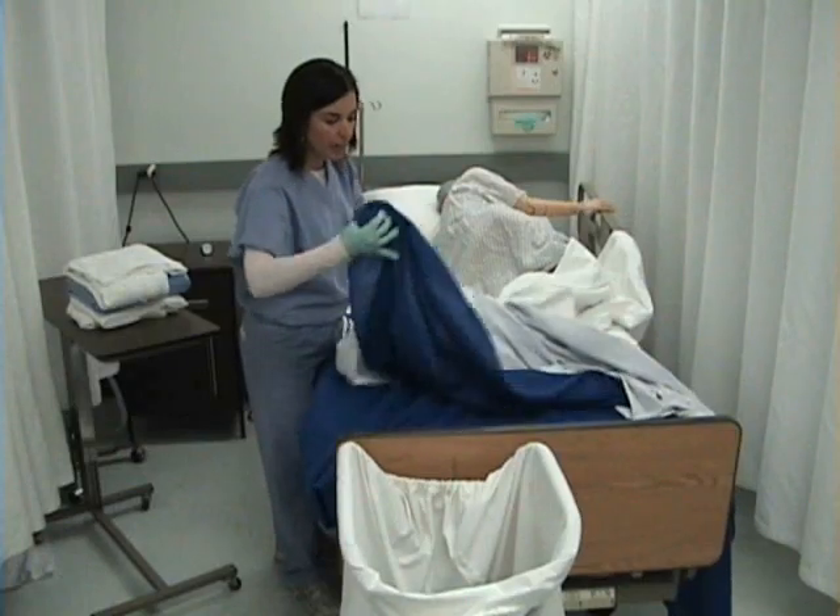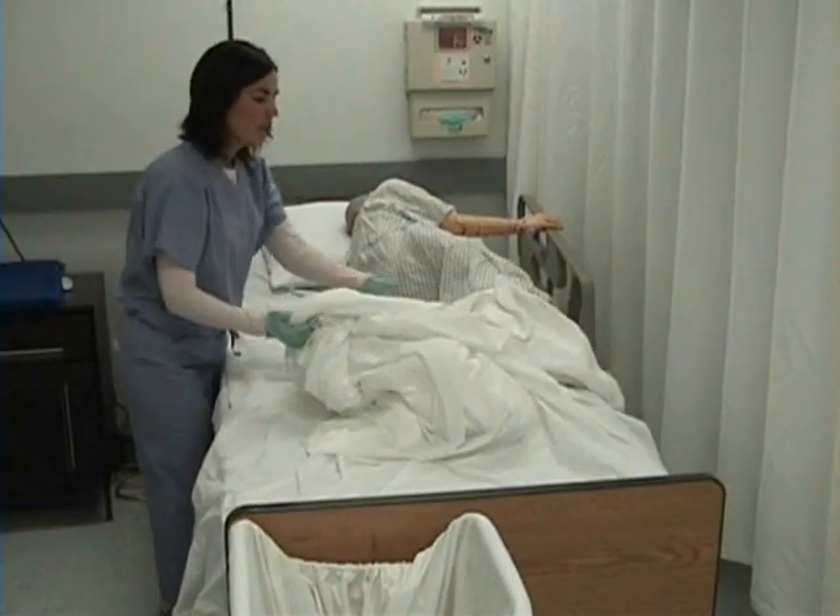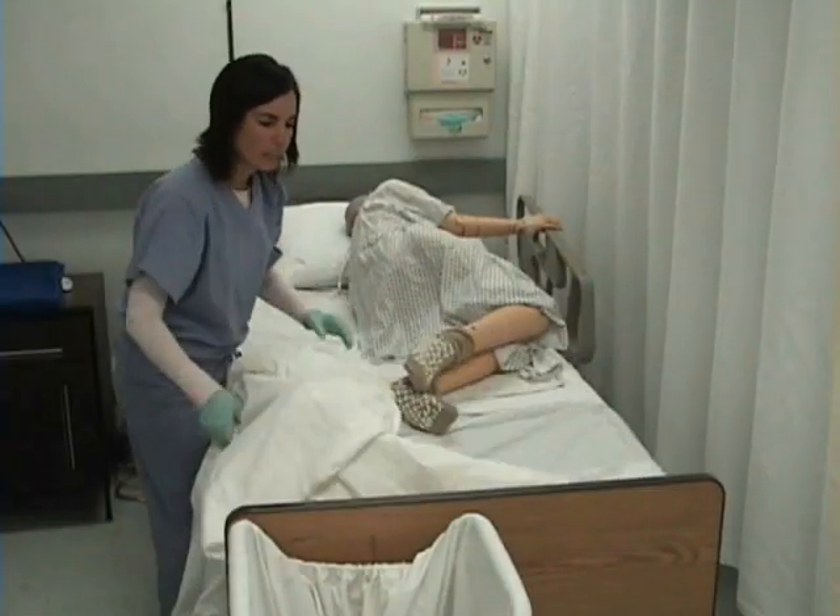I will begin by taking the top blanket off because I'm going to reuse it. I'm going to remove all of the top linens and put them in the linen hamper.